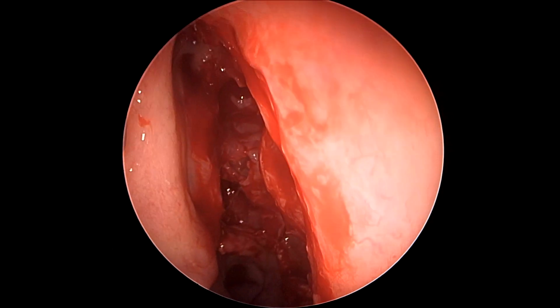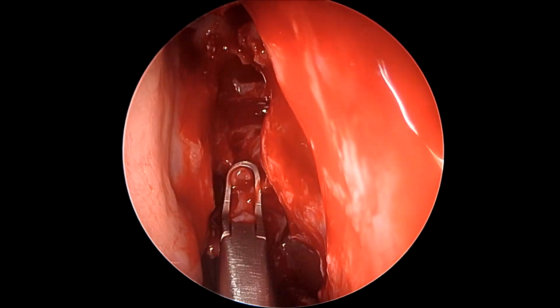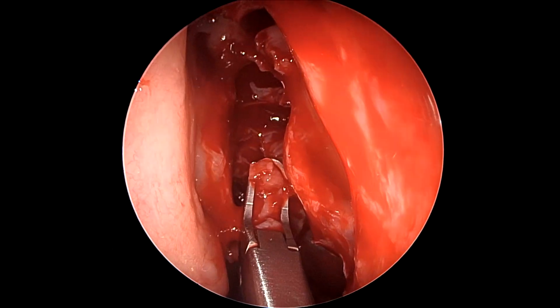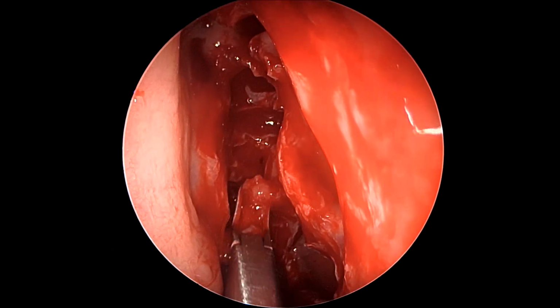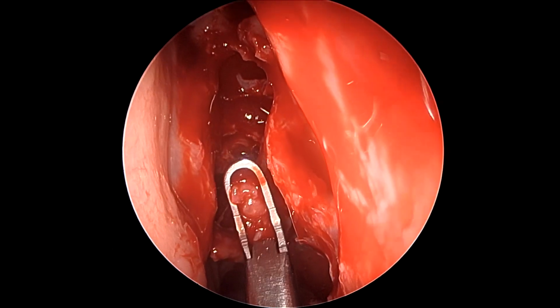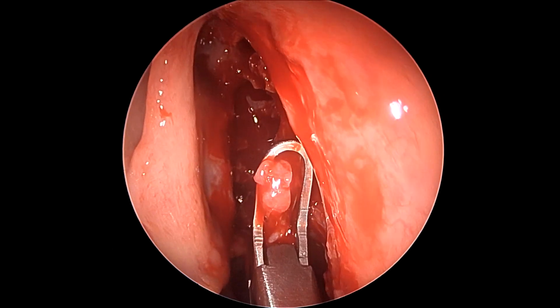So once you see that the sphenoid and the ethmoids have been opened, but that's not complete, now we use this through-cut forceps to each time palpate the skull base and to identify how much more bone lies between the skull base and the ethmoidal cells. And we keep biting into these ethmoidal septations.